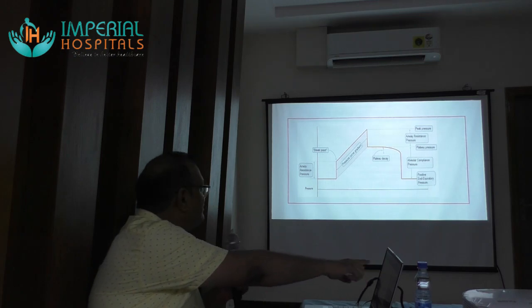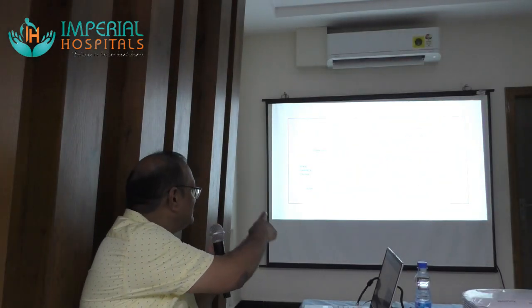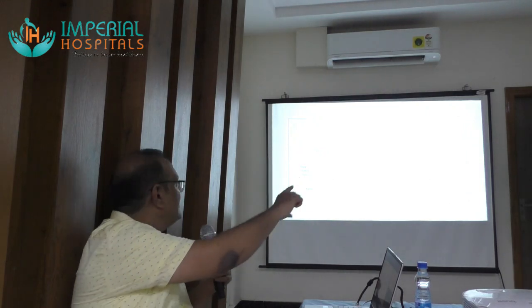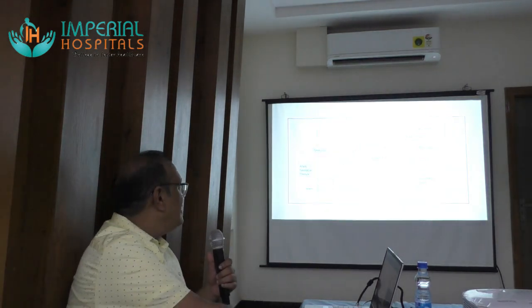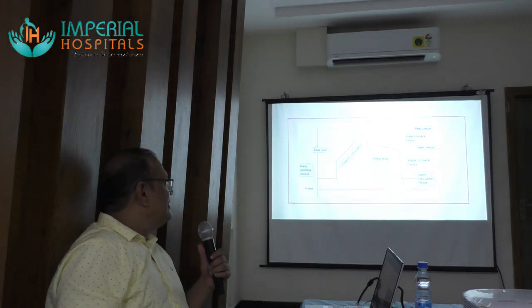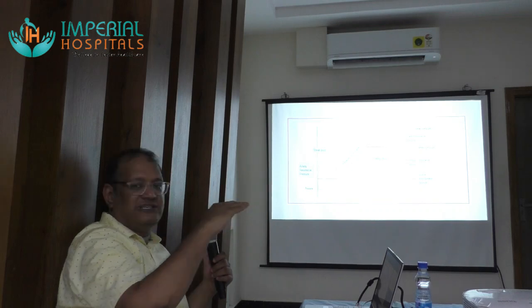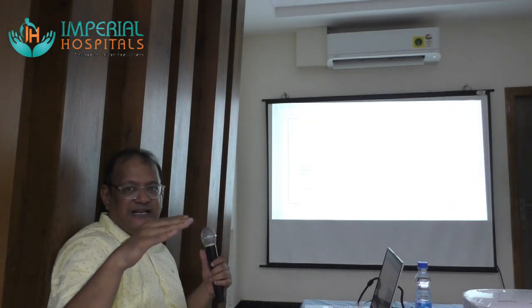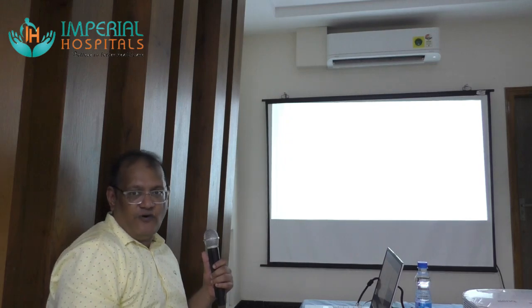After the peak pressure, you'll see a sharp fall, right? That will be equivalent to the initial sharp rise. This will be the peak airway resistance pressure, followed by a plateau phase. If you do an inspiratory hold, the plateau phase will be flat for some time and then slowly start decaying till the end of inspiration, when you'll find a sharp fall.